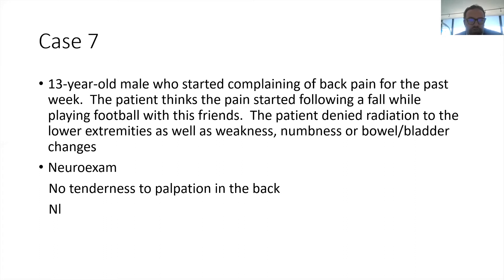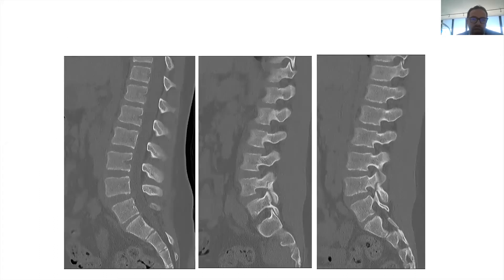With any patient with trauma or a history of trauma, you always want to start not with an MRI, but with an X-ray or a CT scan. You can see here that's the CAT scan.